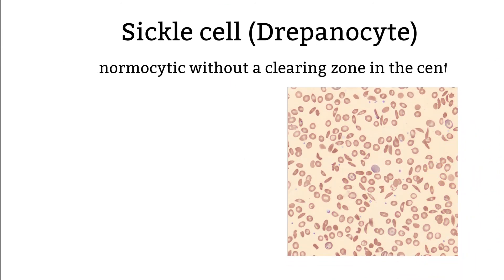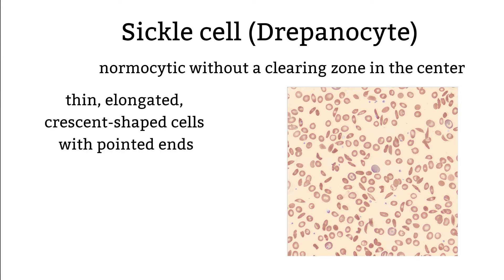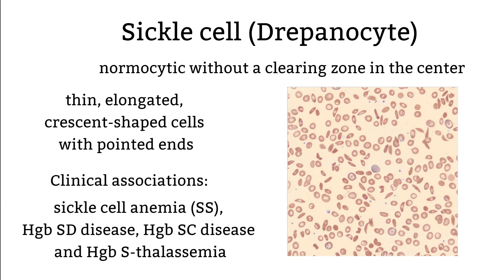Sickle cell. It's usually normocytic with no pallor zone in the center. The shape is thin, elongated, croissant-shaped with pointy ends. This type of cell is present in abnormal hemoglobin S. The cell becomes inflexible and deforms as it passes through the microcirculations of the spleen. Many sickle cells can reverse back to normal shape — the reversible cell shape is thicker and rounder with no pointed ends. Here are some diseases associated with this type of morphology.